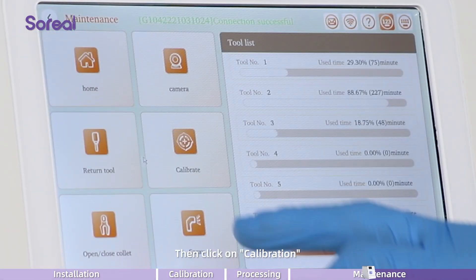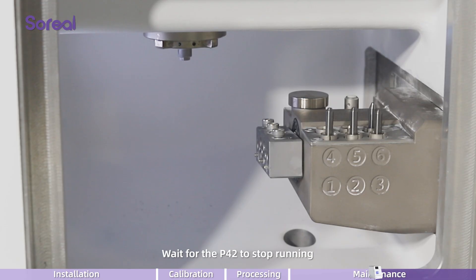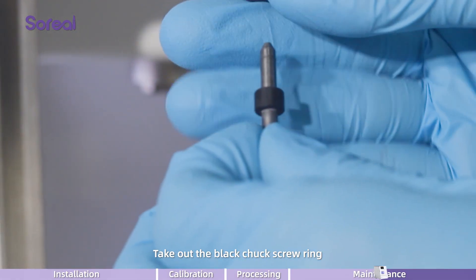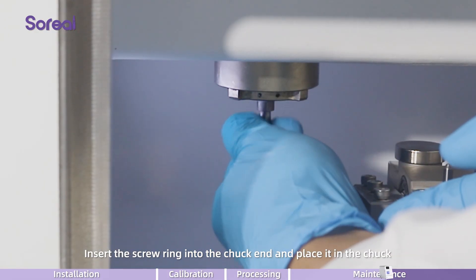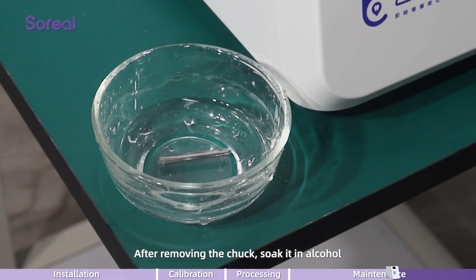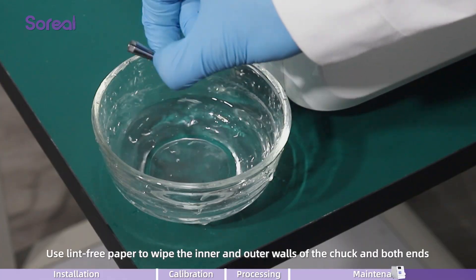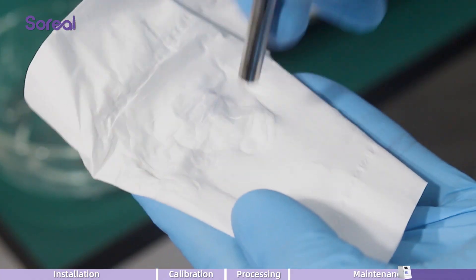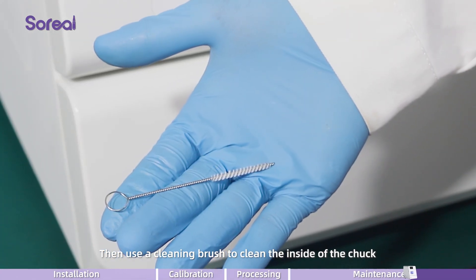Click on the maintenance button, then click on calibration, then click on chuck cleaning, then click on open. Close the collet and wait for the P42 to stop running. Take out the maintenance tool kit and the black chuck screw ring. Use it with the milling burr. Insert the screw ring into the chuck end and place it in the chuck. Using the screw ring, loosen the chuck counterclockwise and remove it from its position. After removing the chuck, soak it in alcohol. After soaking, use lint-free paper to wipe the inner and outer walls of the chuck and both ends. Make sure it is clean and free of visible stains. Then use a cleaning brush to clean the inside of the chuck.